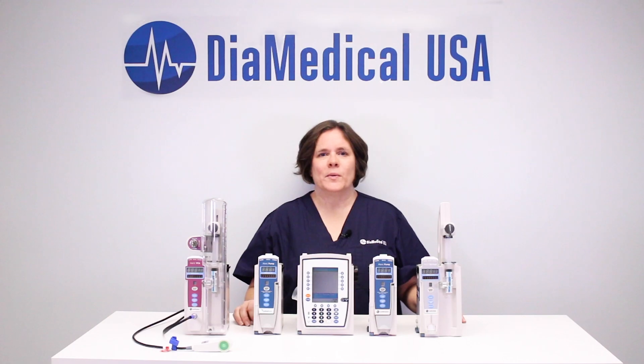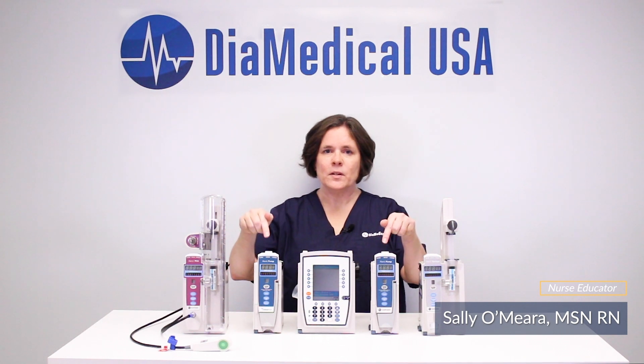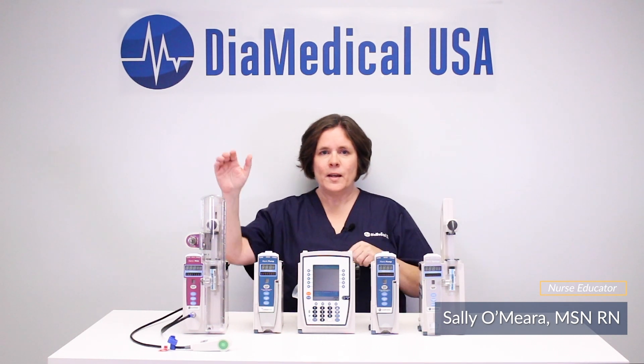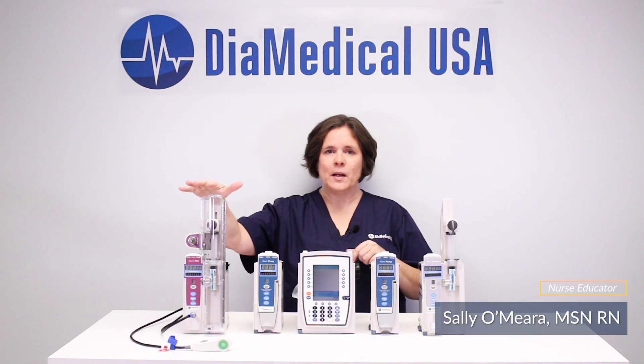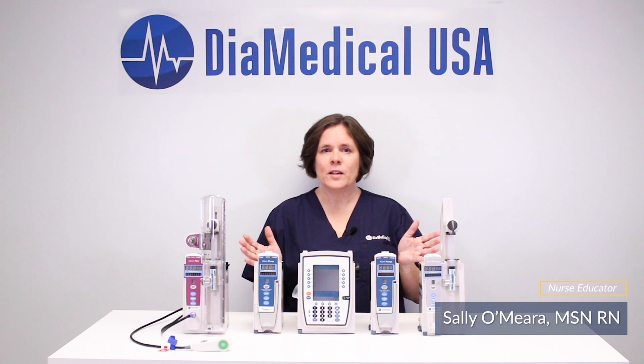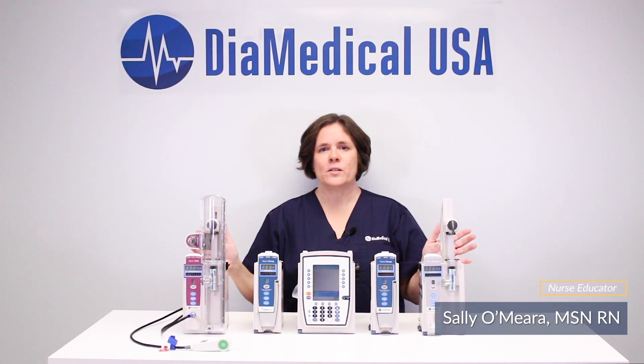Hi! Today we'll be reviewing the Alaris Medley smart pump system with the 8015 point of care unit, 8100 pump modules, the 8110 syringe pump, and the 8120 PCA module. We'll also be highlighting the DIA Medical USA Educational Drug Library, which is a standard feature on all of our Alaris smart pumps.